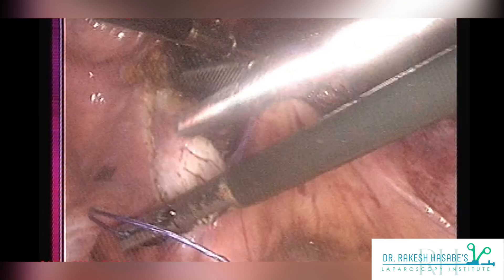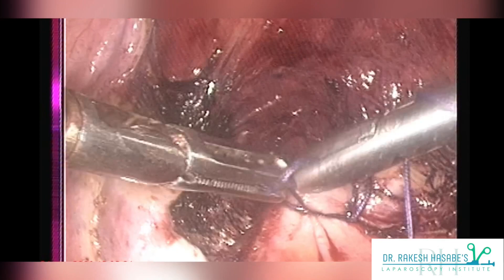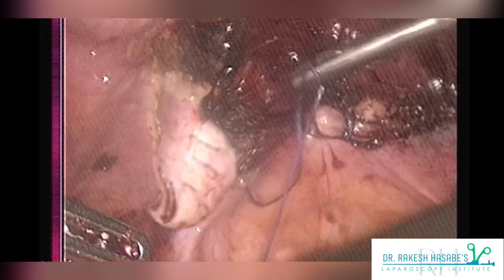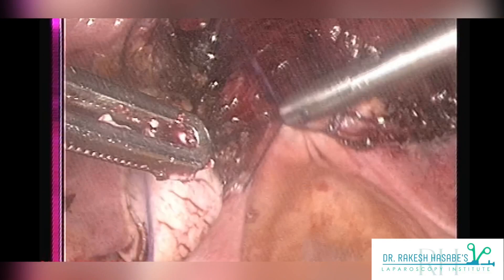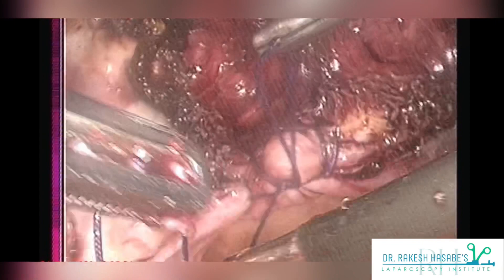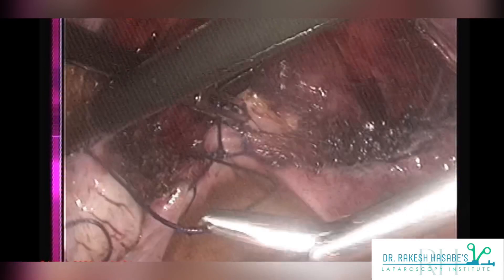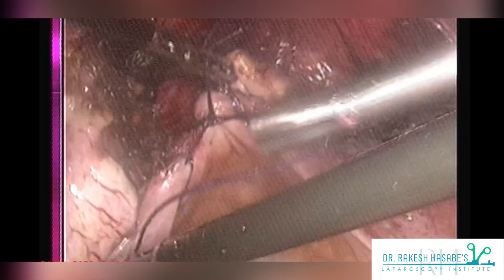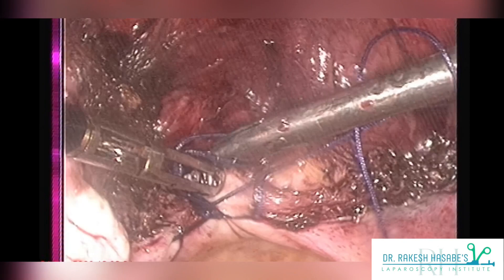On one side I used a loop just like that of V-lock or Quill to tie a knot. On this opposite side I will demonstrate how to tie the knot. The first step is to form a C — you can see clearly I have formed a C. Then pass your instrument through it twice and hold the loop which was left for grasping and tie the knot. Some people use the curvature of the needle to form a loop around their needle holder before they hold the other sided loop. Others hold the thread with the right-handed instrument and rotate it around the left-handed instrument. Follow whichever technique feels good for you. Now I am forming another C, passing my instrument through it, holding the other-sided loop, pushing it downwards — and this is the final knot.